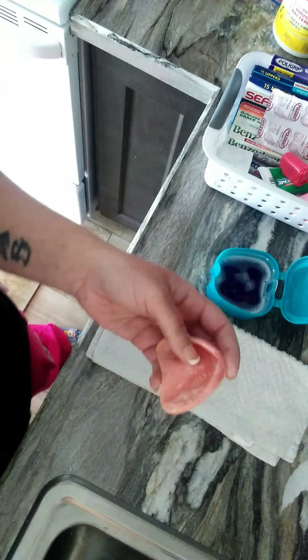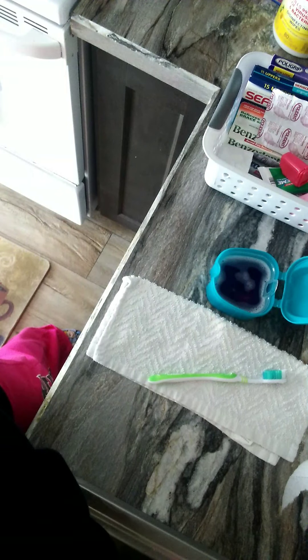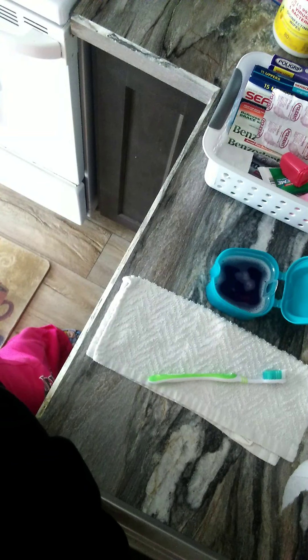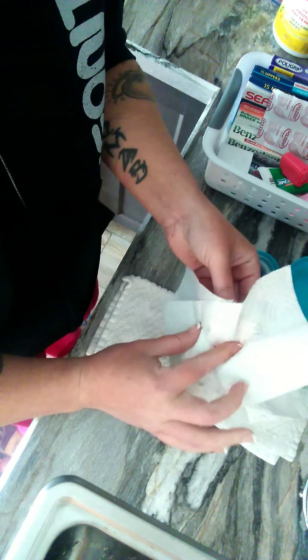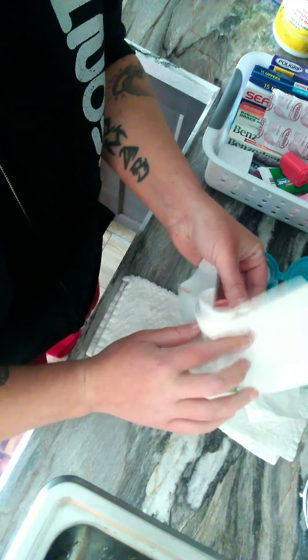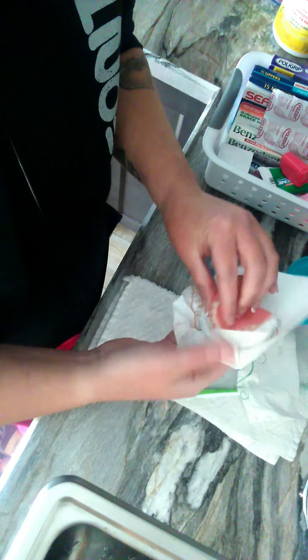So what I do is I rinse it off. Give me one second. Steven, can you get me a couple of Q-tips, please? Having my son get Q-tips so I can spread my adhesive. So what you do is you take a paper towel and you very carefully get in the trough, get in all the areas, make sure your teeth are nice and dry.